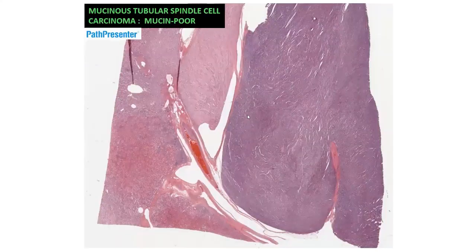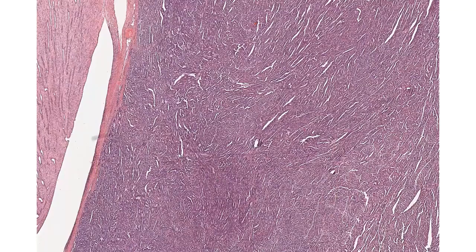However, in this particular case, you might have a problem in the sense that the mucinous element as well as the spindle cell element both are poor. Both are less well represented in this particular example. So this is an example of a tubular element rich mucinous tubular spindle cell carcinoma. However, as you see, as is the nature of this tumor, it's a very well circumscribed tumor where it is well delineated from the adjacent renal parenchyma.